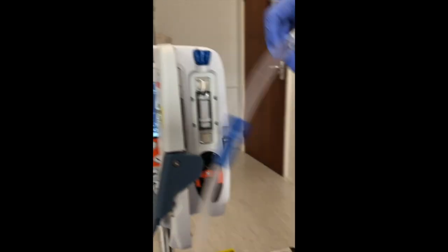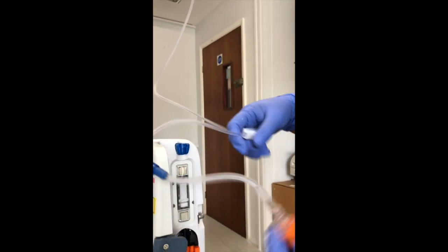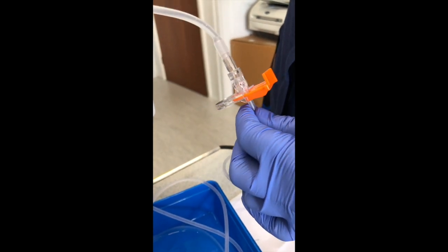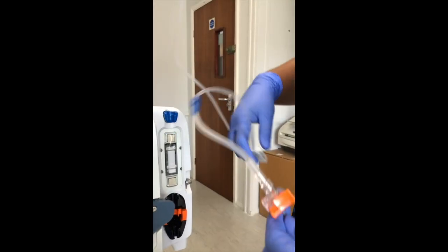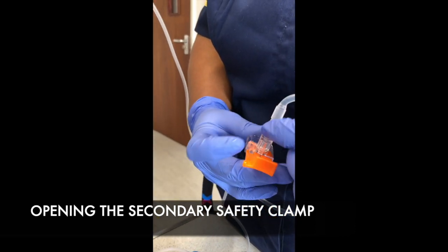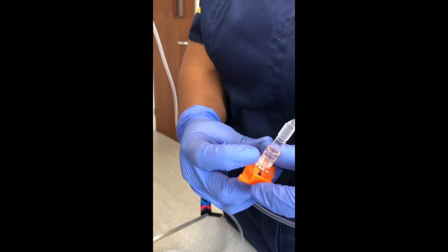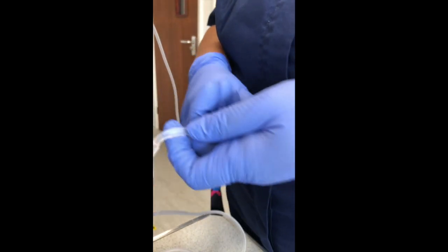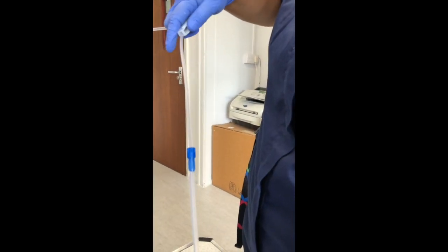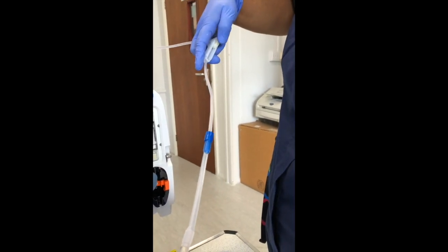The pump has a secondary safety feature. If your roller clamp is not clamped, it comes out clamped for you so that your patient's not going to get a siphoning. So to get rid of the air, roll your clamp down, and to get rid of the second clamp, you push this clear part upwards and this orange bit inwards. So up and in. And then you can, while disconnected from a patient, slowly open your roller clamp to get rid of the air that's in there all the way out.